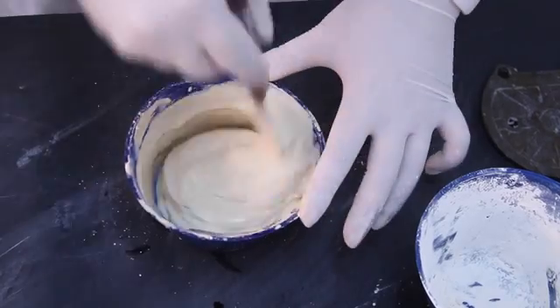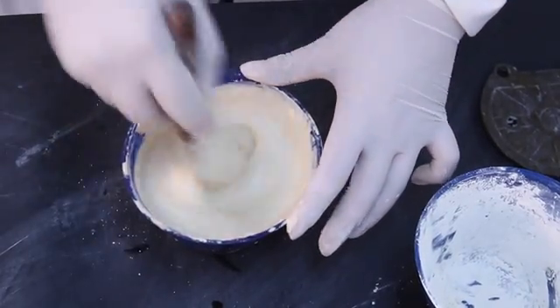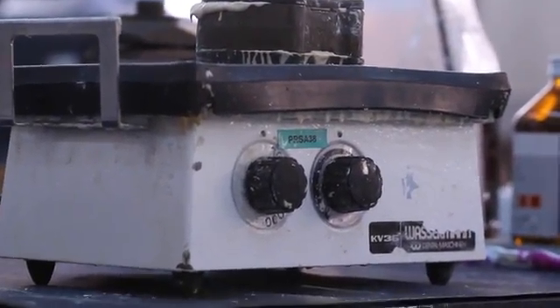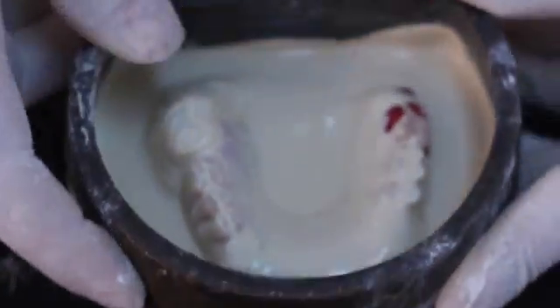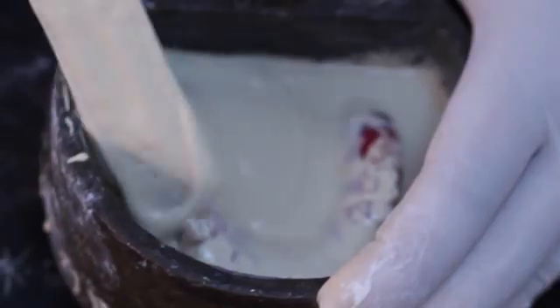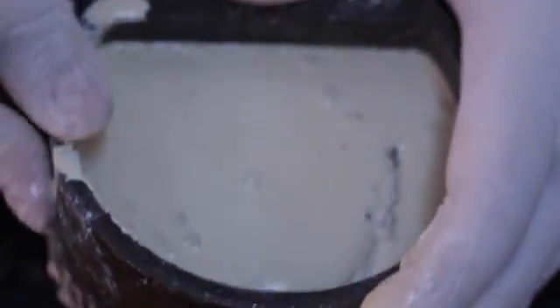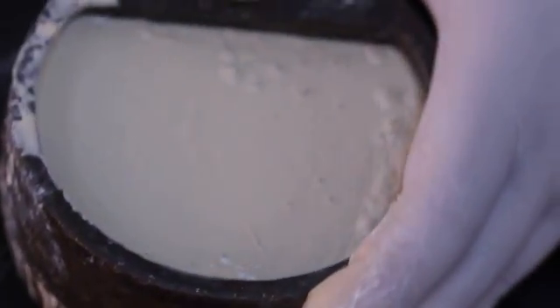The second investment layer is prepared using type 3 dental stone. The stone is applied onto the wax and the prosthetic teeth. Care is taken not to trap air bubbles around the necks of the teeth. At this stage, the middle portion of the flask is positioned and the stone is vibrated into the flask. The top of the flask is then pressed into place immediately, and the flask is set aside for a minimum of 1 hour before the wax elimination process is begun.